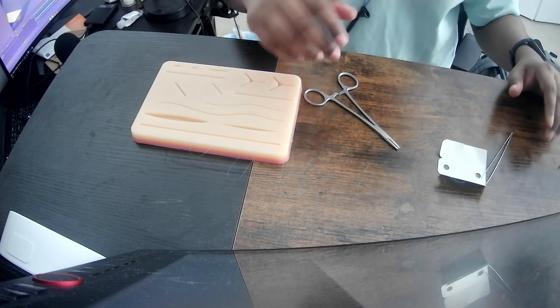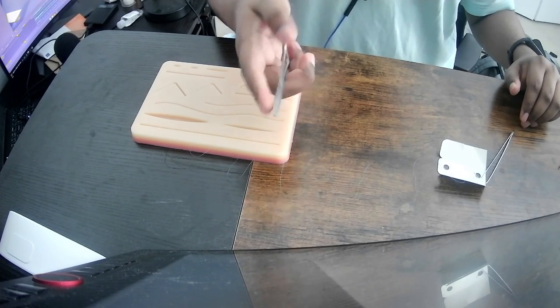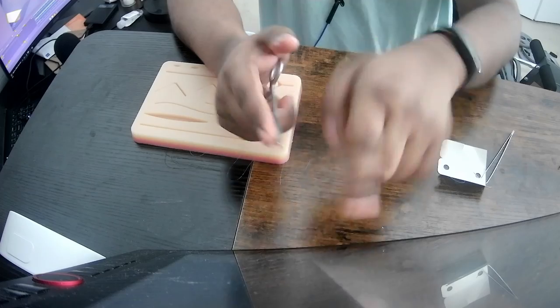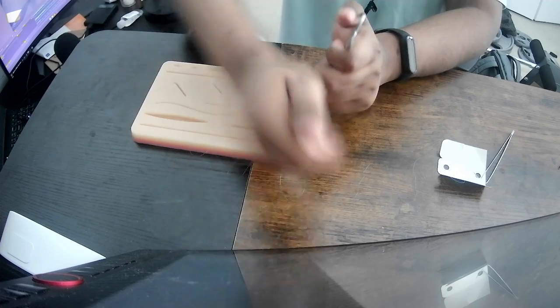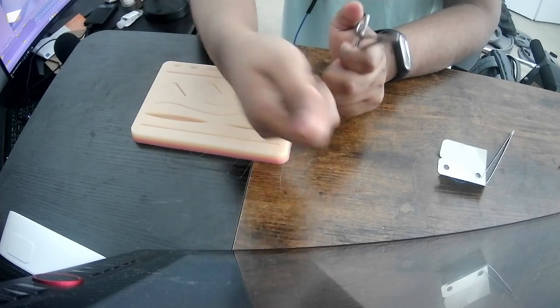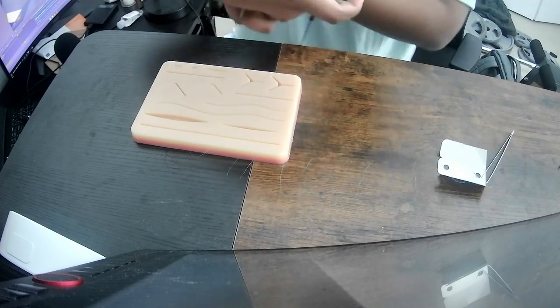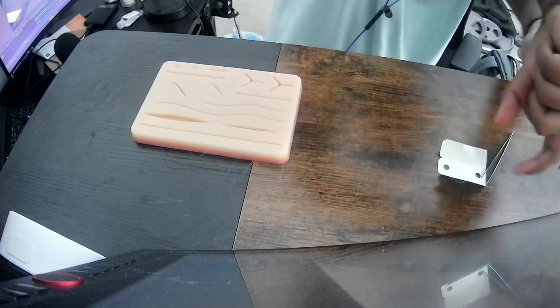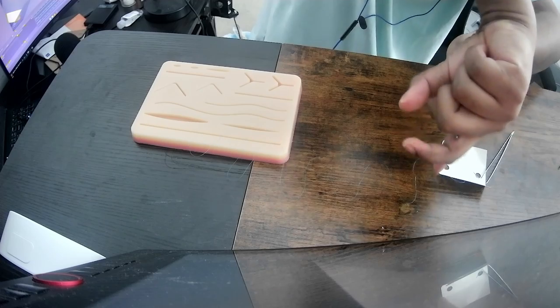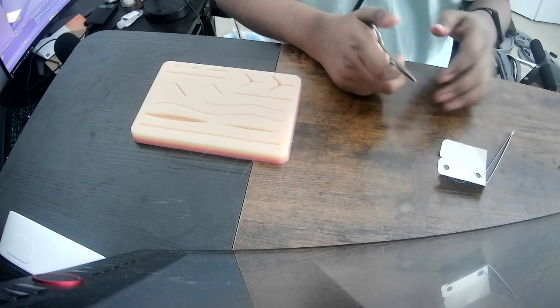Okay, so basics. If I'm right-handed, like this, and holding the needle driver, I want the needle's hook to face like this, inside, so I can drive it like this. So the hook would be like this, driving through. And if I'm left-handed, the hook would be like this. Right, like this. Okay, that makes sense.